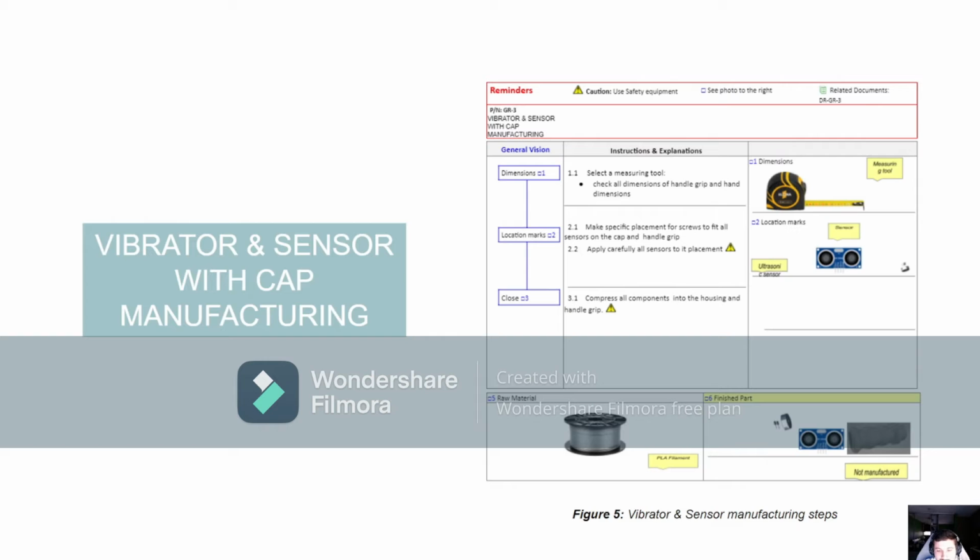On the right will be the cap with the ultrasonic sensor and the handle grip, which is not manufactured yet.